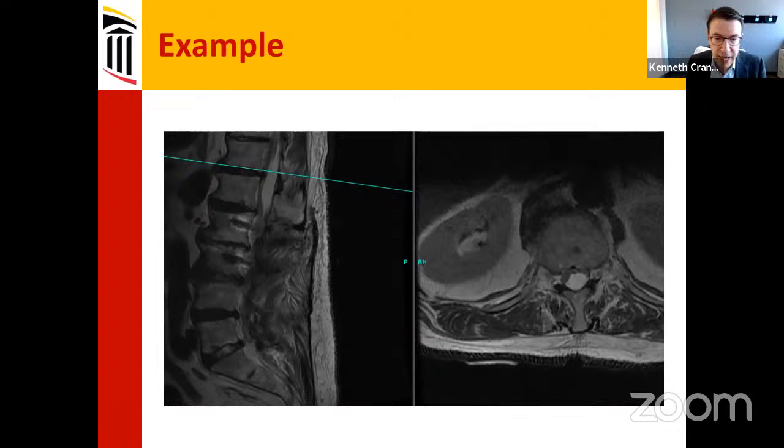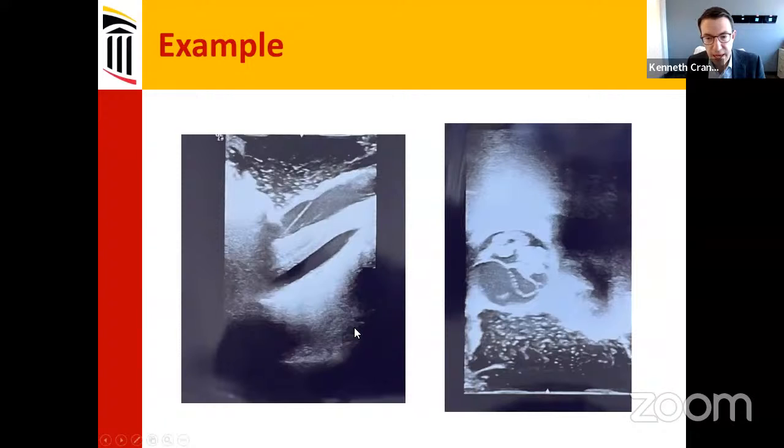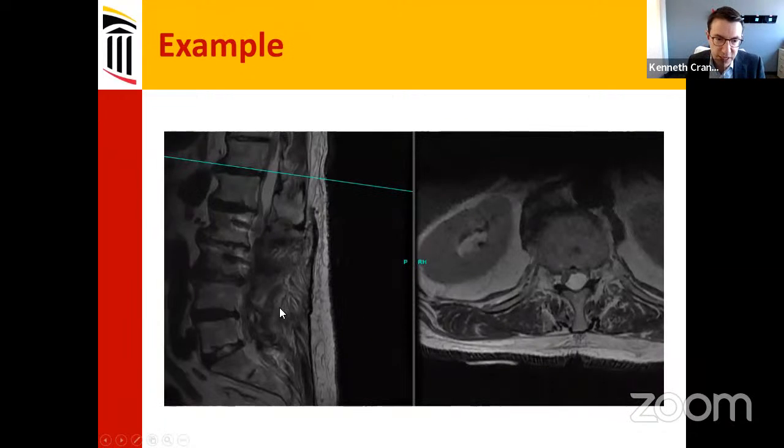And so we did take him back to the operating room, and we basically opened him up, and down here again we didn't really find a hematoma. We just found very swollen muscle, along with a little bit of a seroma that was causing some compression of the thecal sac. Then we did a laminectomy where we removed more of L1 and T12.